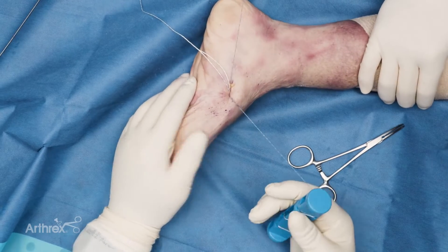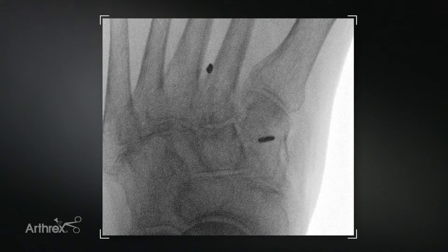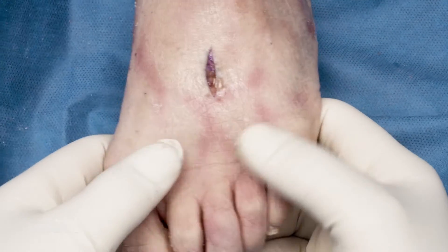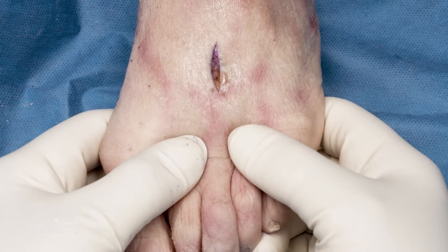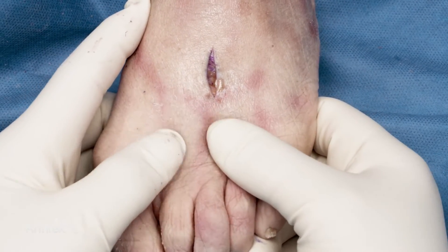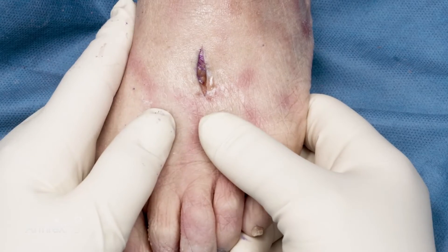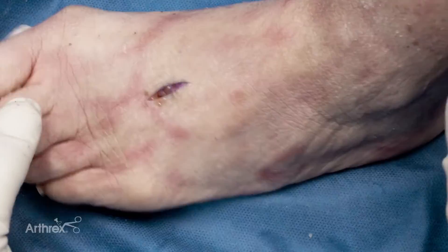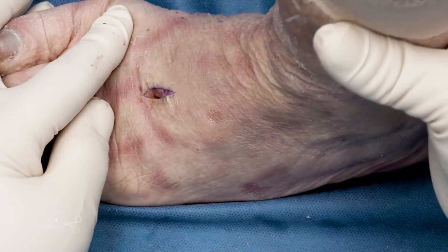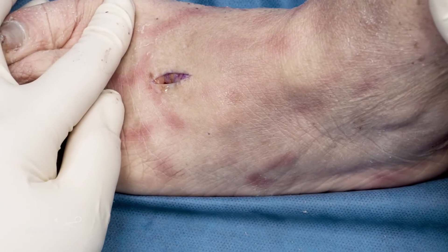If you want to double check to make sure you've reduced it, you can check it under x-ray. You can actually see you almost sucked down the second metatarsal in this arthritic foot. Not only have you reduced it, but you've allowed for sagittal plane motion between the metatarsals — so you don't have a screw device locking up that second tarsal metatarsal area. Once healed, it's a nice way to anatomically align the second tarsal metatarsal joint while allowing an athlete sagittal plane motion once they're back to normal. A nice way to reduce it without having to fix it later.